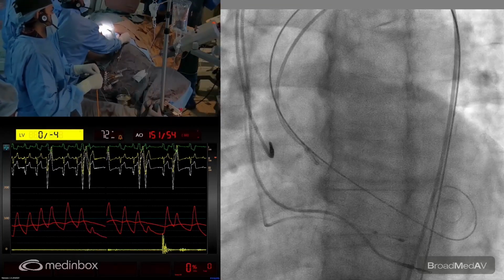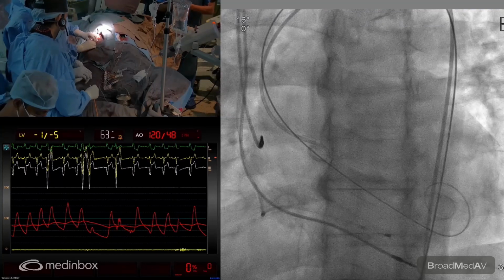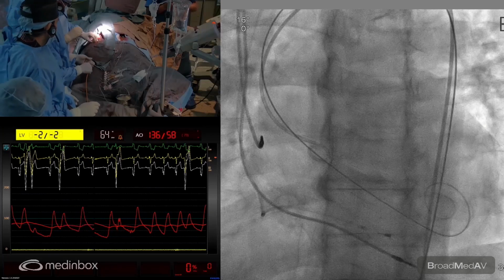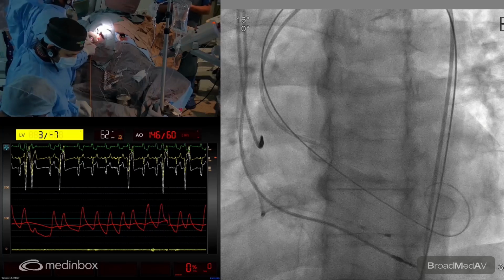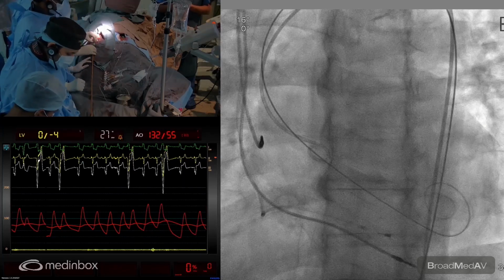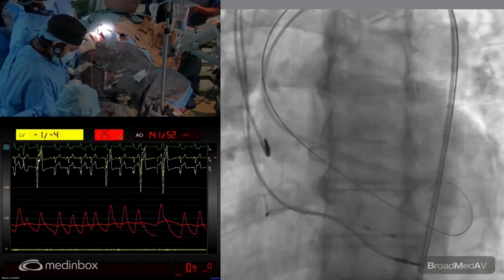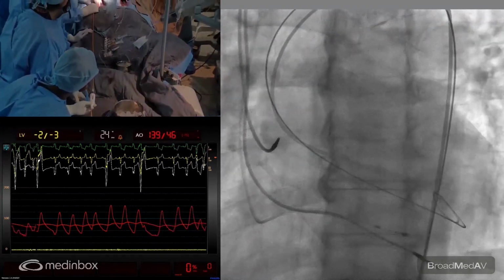Fluoro, sir. Yeah. So the NCC. Okay. Good. Thanks. Okay. So as you can see, there's a parallel up. Fix the introducer here. Please hold the wire there. Yes. So Fluoro, sir. We have the metal logo, follow it and go in slowly, with the logo being up at 12 o'clock position.